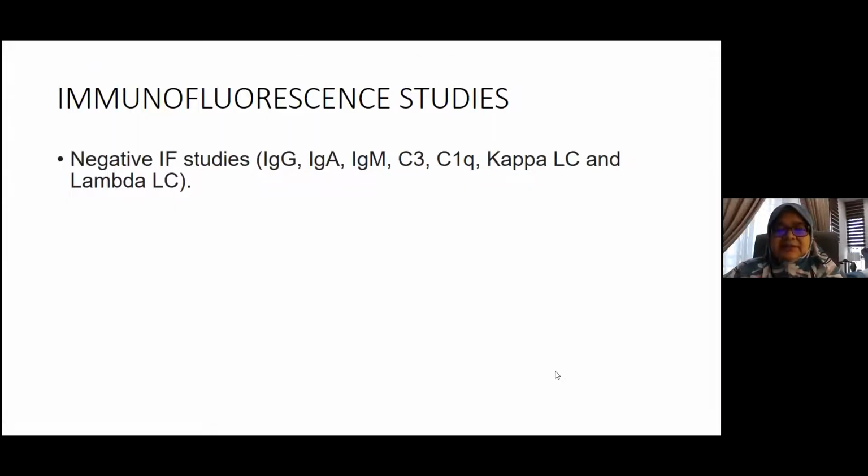Basically, as I said, it was a focal sclerosing pattern, and the immunofluorescence are all negative.